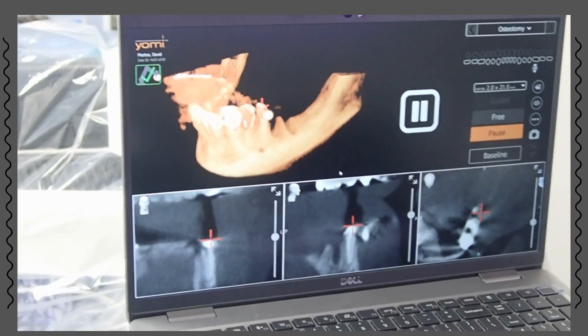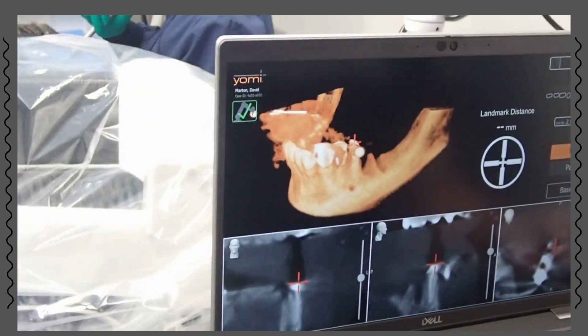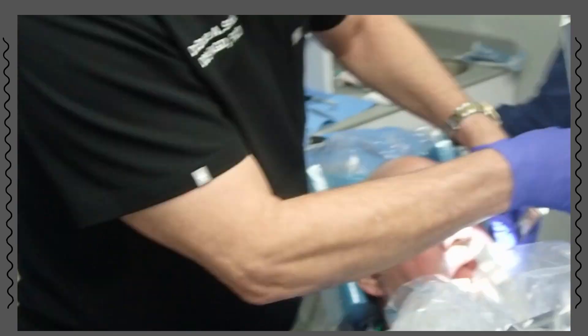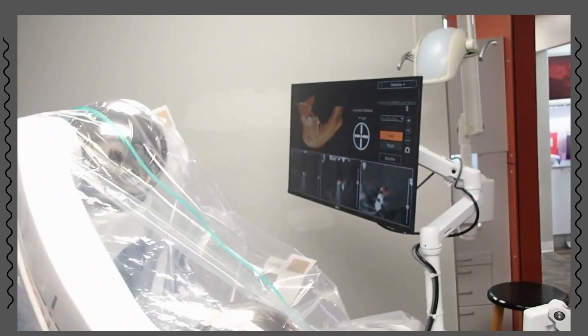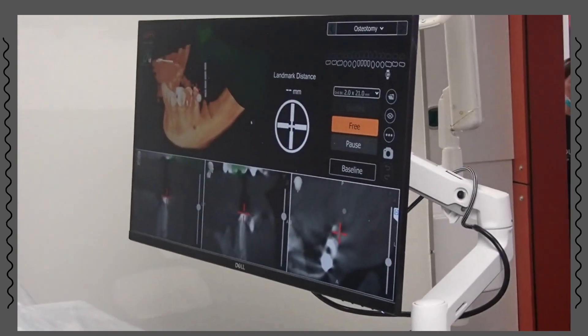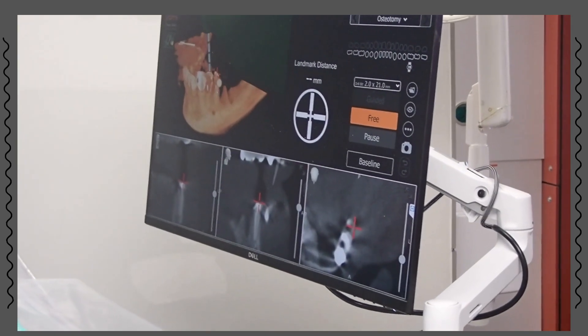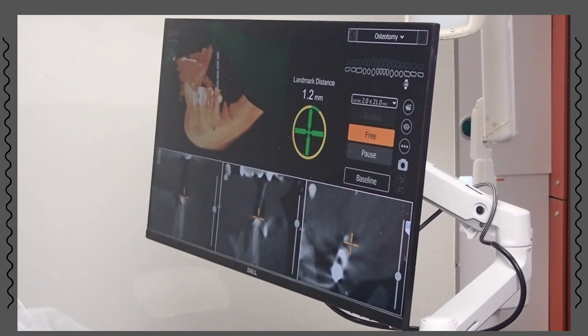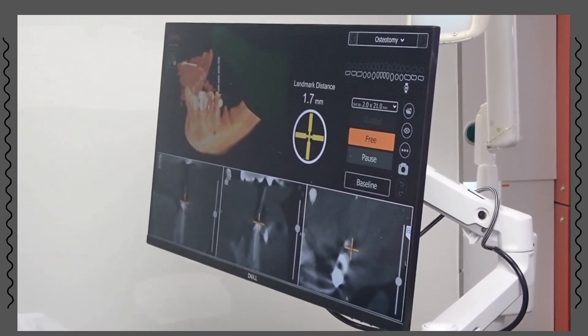There's going to be a lot of water, okay. So now what we're going to be doing is placing — open real big — placing the tip right where we want it. Landmark on number 20. Twenty is the prep tooth. A little more buckle. Hold it.